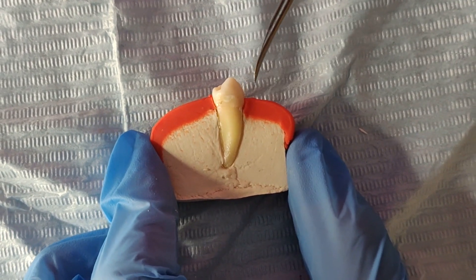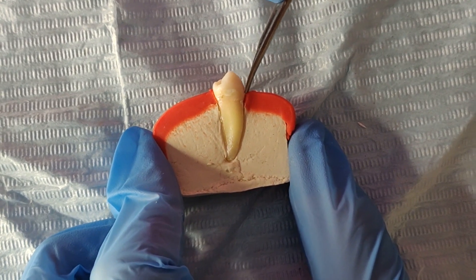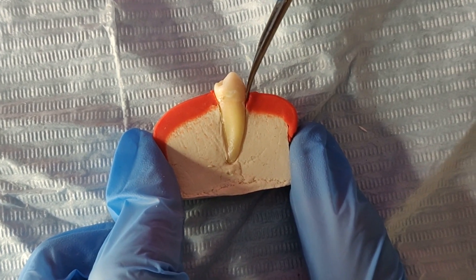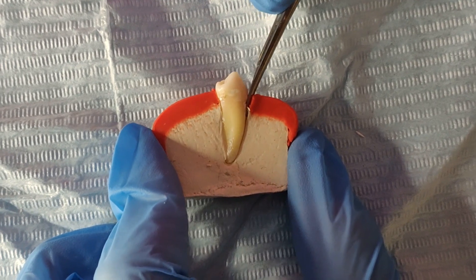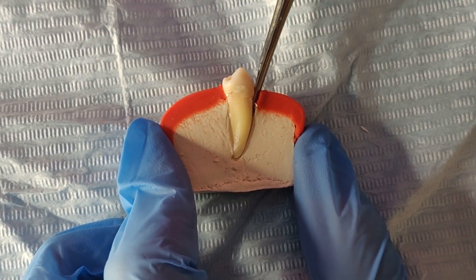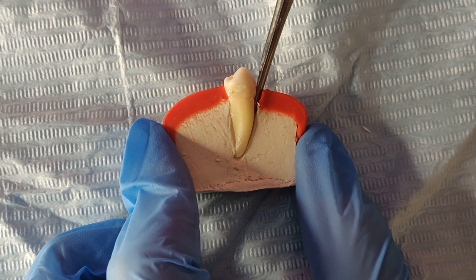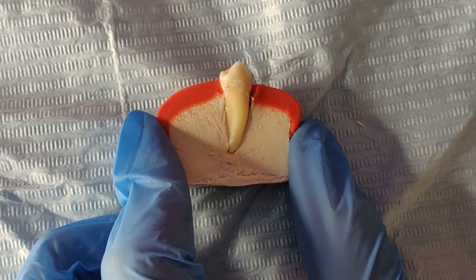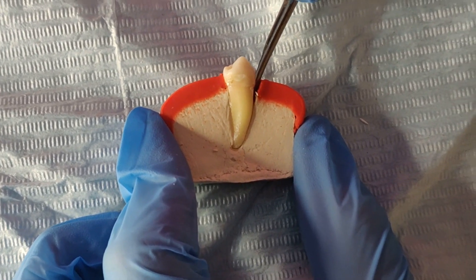The wedge principle is used by positioning a straight elevator tip between the tooth and the alveolar bone and applying slow and constant apical pressure to tear the periodontal ligament attachment from the bone and luxating the root or the tooth.